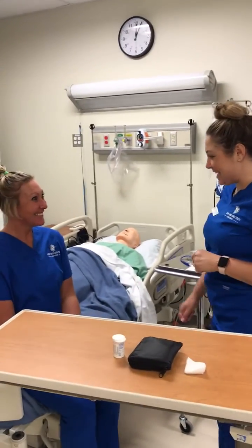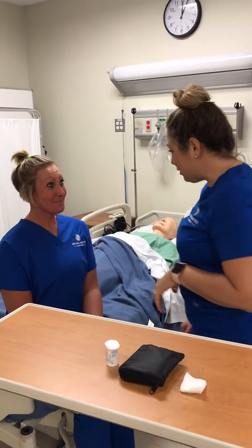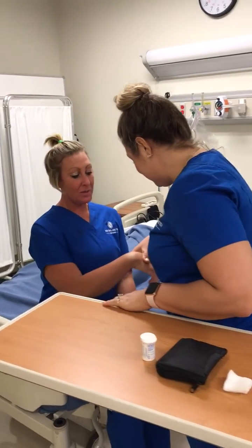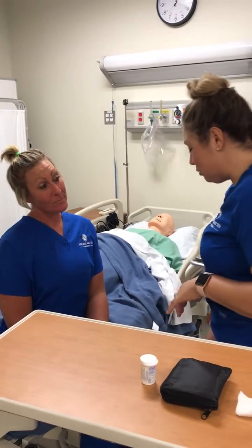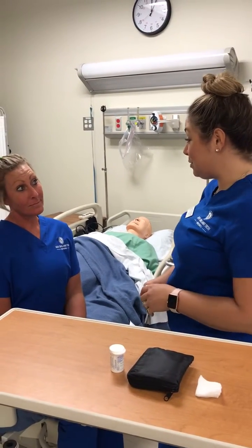Hi, I'm Julie and I'm going to be your nurse today. Can I have your name and date of birth, please? My name is Julie Bugai, date of birth 7/18/83. I have an order here to perform a blood glucose test.